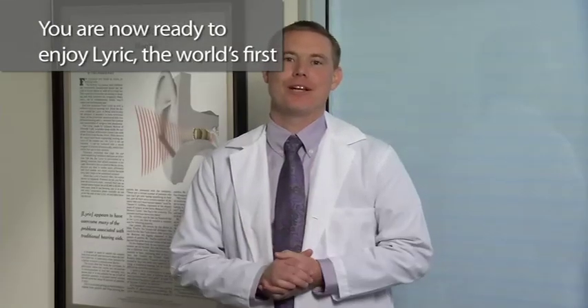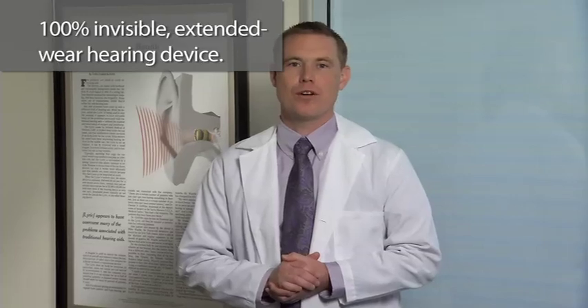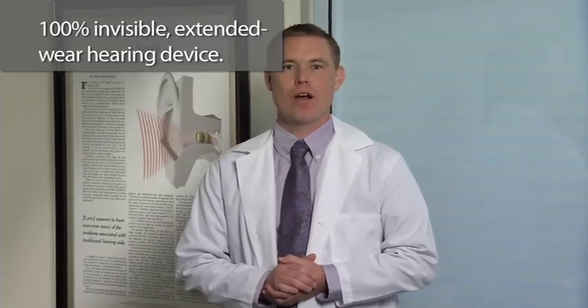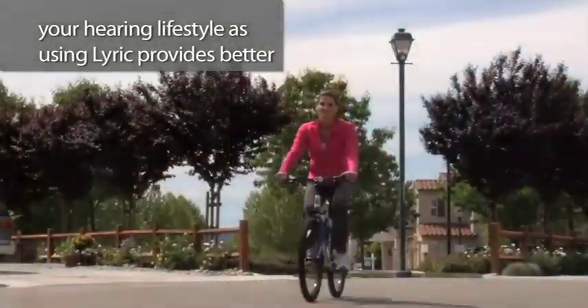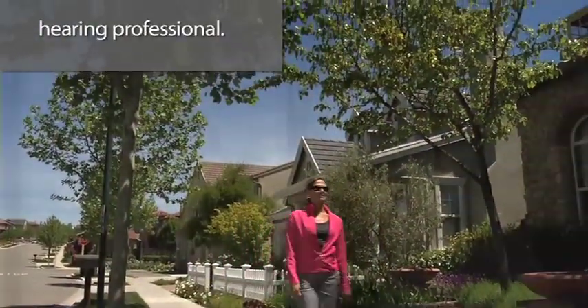You are now ready to enjoy Lyric, the world's first 100% invisible extended wear hearing device. You've made a wonderful decision about your hearing lifestyle — using Lyric provides better hearing 24 hours a day, seven days a week. It's always with you and you don't have to miss a thing. If you have any questions, please ask your hearing professional, review this video, read the user manual, or call your hearing professional. Today, you begin your experience of better hearing 24-7.